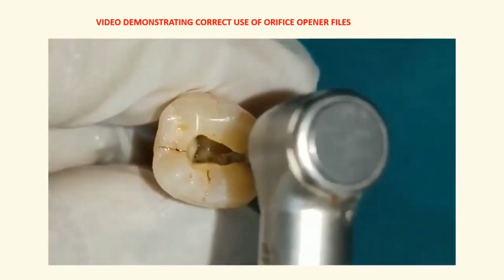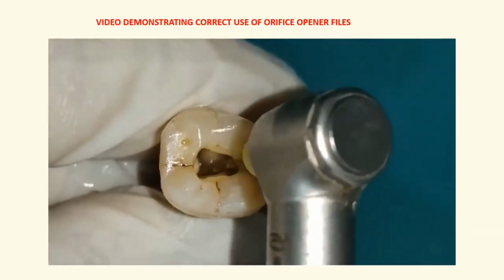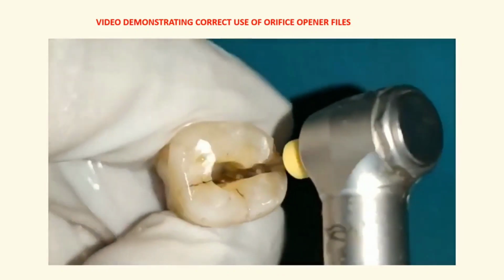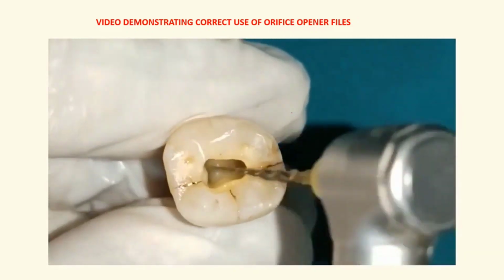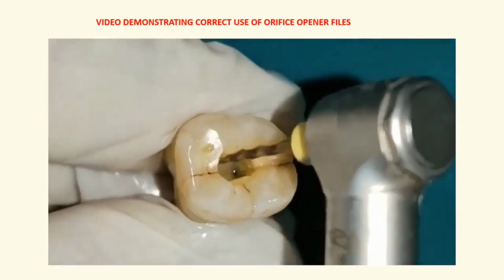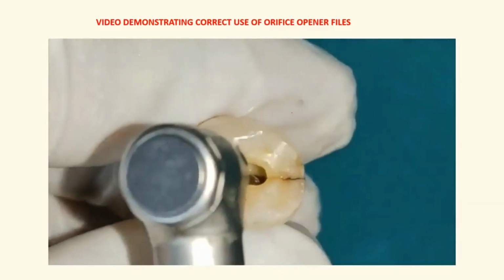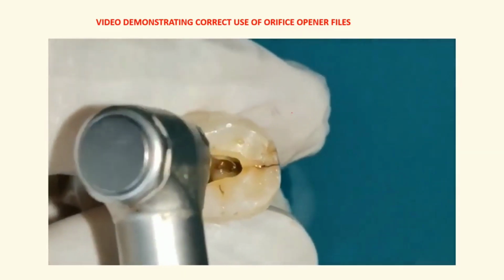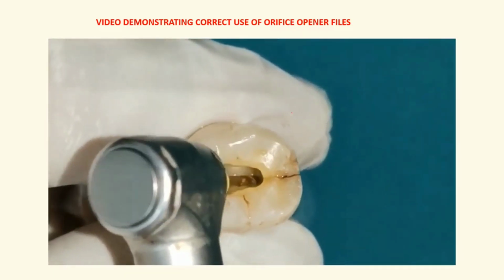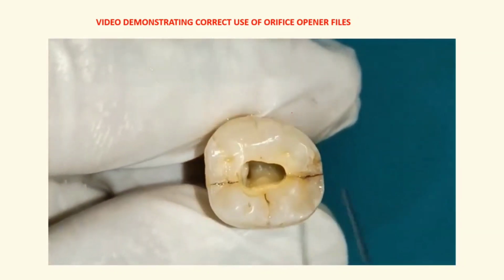This is a small video demonstrating the correct use of orifice opener files. See the motion of the file. Backstroke brushing motion with light pressure. Away from the furcation. I am not pushing the file down into the canal. Just brush and follow.